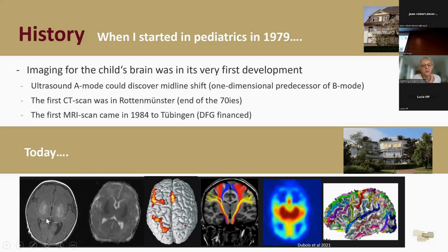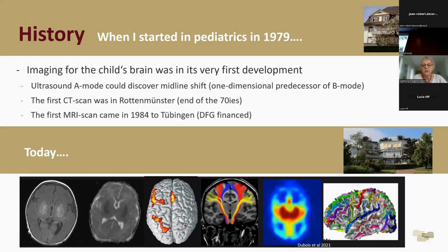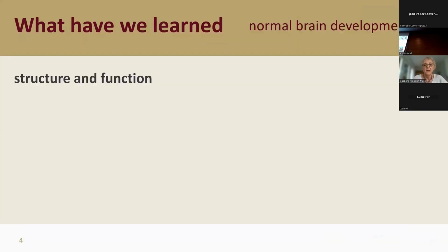You can not only visualize lesions, you can visualize their acuity, you can visualize the function of the brain in a complex network, and you can visualize the tracts. I have these last two examples from a beautiful review. You can visualize perfusion and also complex brain morphometry.